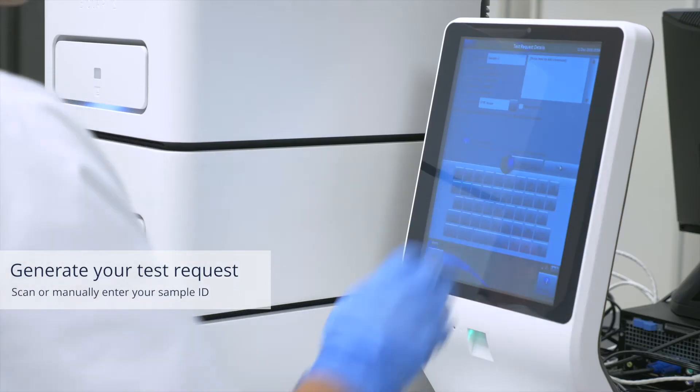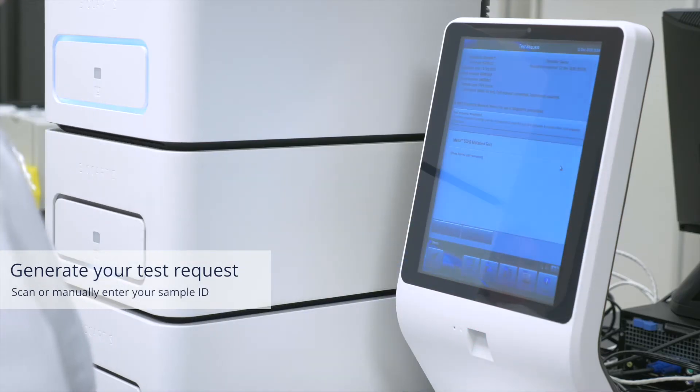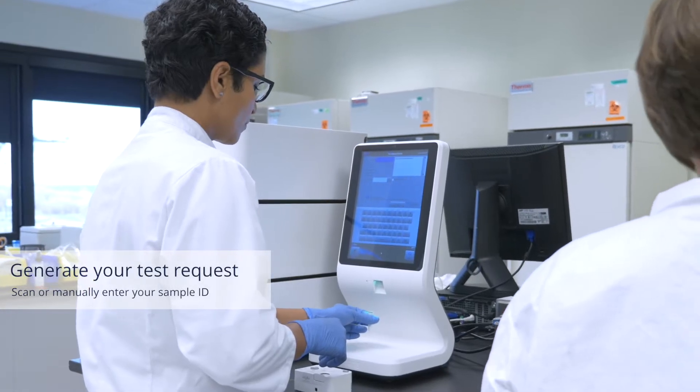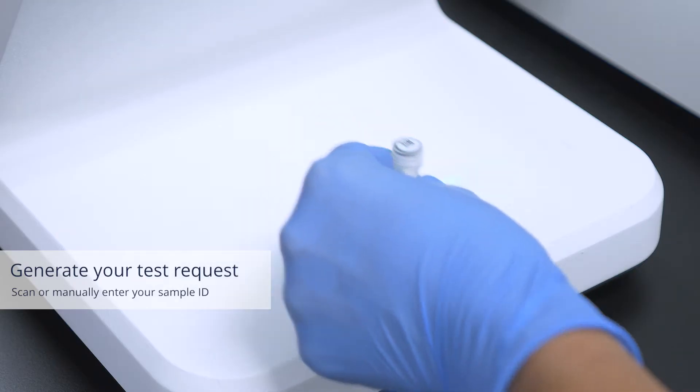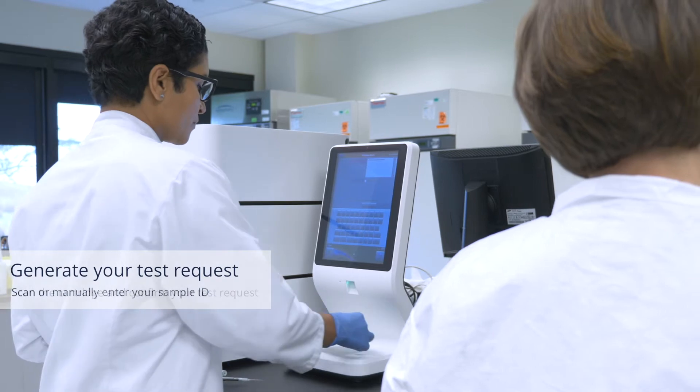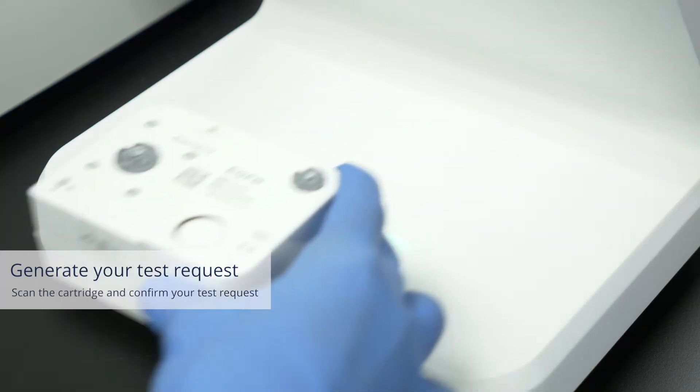Use the console to generate a new test request. Enter the sample ID by scanning the barcode. You can also enter the information manually. Scan the cartridge and confirm your test request.